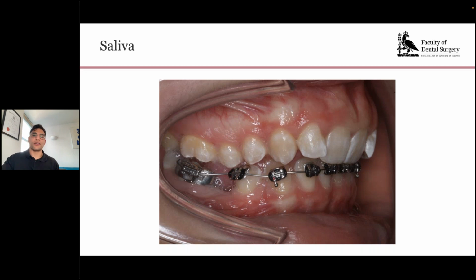Some people like to educate the patient to try and swallow all the saliva in their mouth, but that never really does it adequately. So you need to suction all the saliva out to make sure things are absolutely bone dry. And then if on top of that you use a diffuser, things look even more drier and professional.